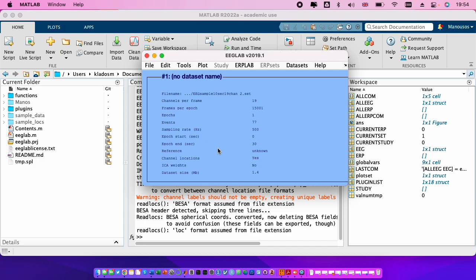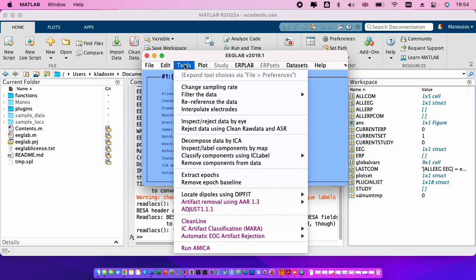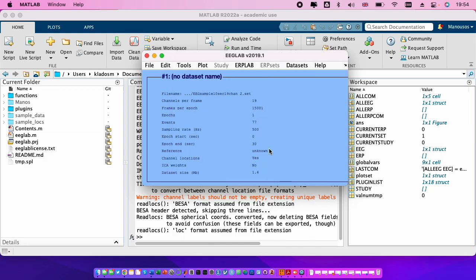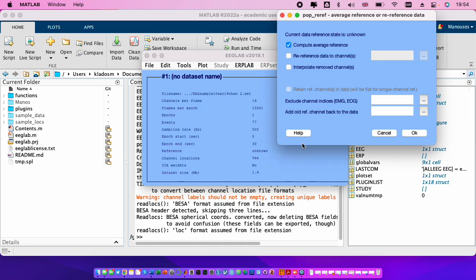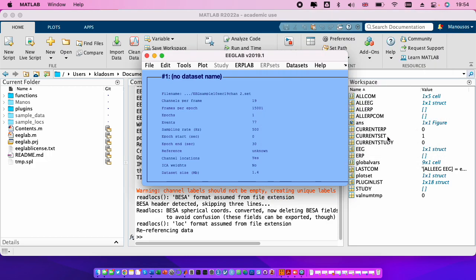So the next step is to make the reference. Now we will use the common average reference. We go to tools, re-reference the data, compute average reference is already checked, so we press ok.